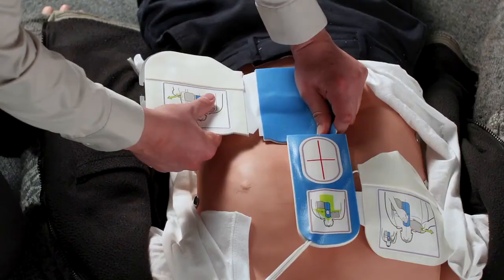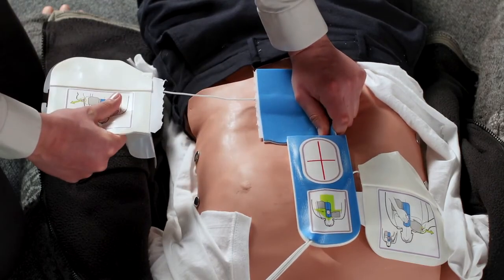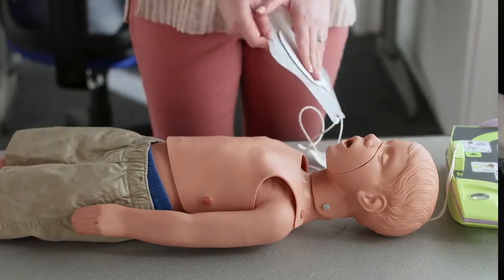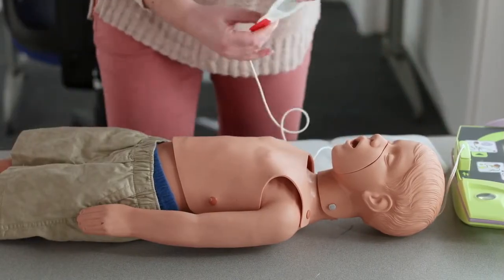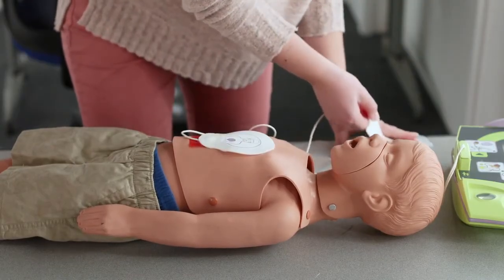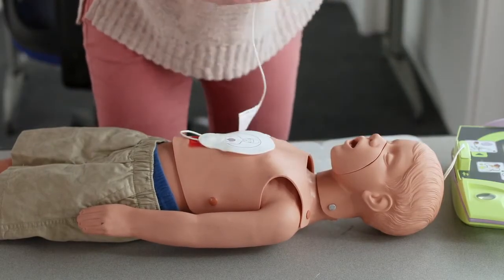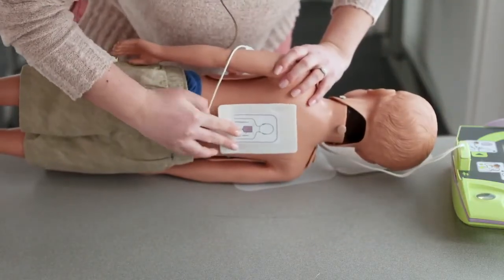CPR-D pads should be used on victims over 8 years of age or 55 pounds. CPR-D pads can accommodate larger victims by separating the side pad at the slit as shown. For children under 8 years of age and under 55 pounds, pediatric pads should be used. For children, pads should be placed on the center of the chest and center of the back as shown. Using pediatric pads on an adult is not recommended.